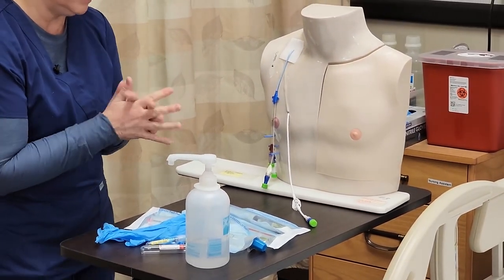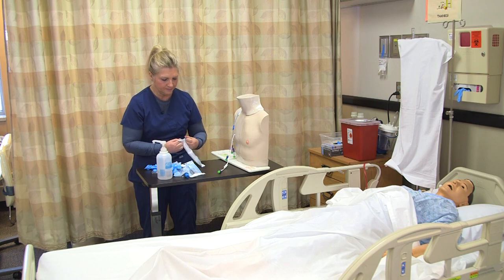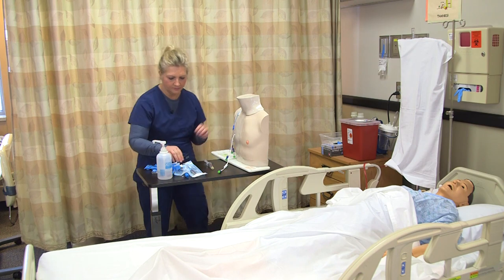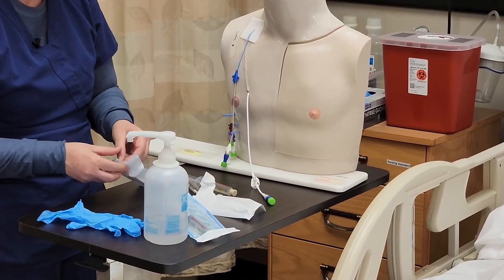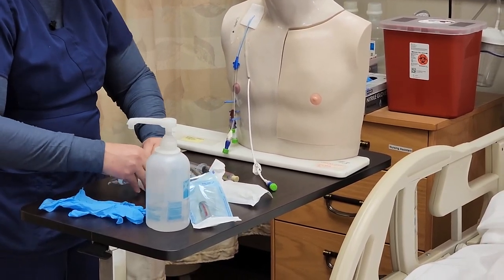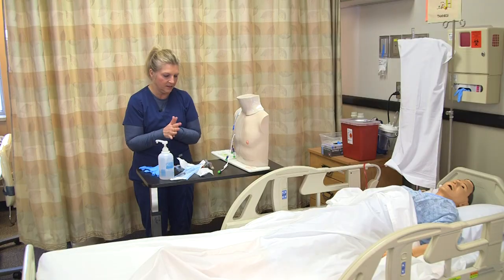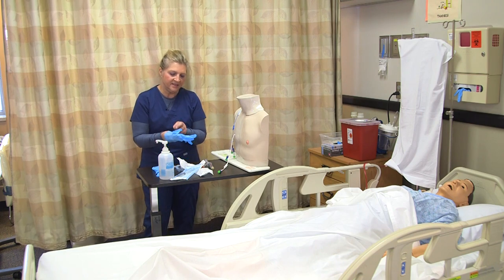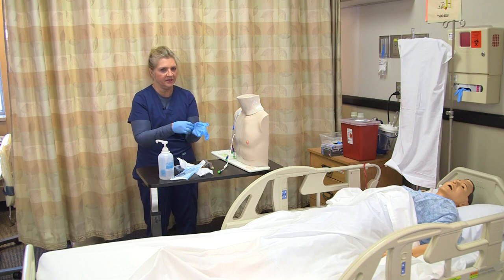I'm going to wash my hands and get my supplies ready. Everything is open that I need so far. I'll wash my hands and put my clean gloves on. I'm also going to make sure that I am implementing aseptic non-touch technique, noting that we do not want to touch any areas that might introduce bacteria into our central line.